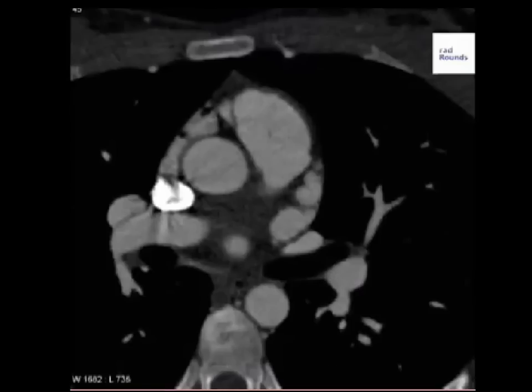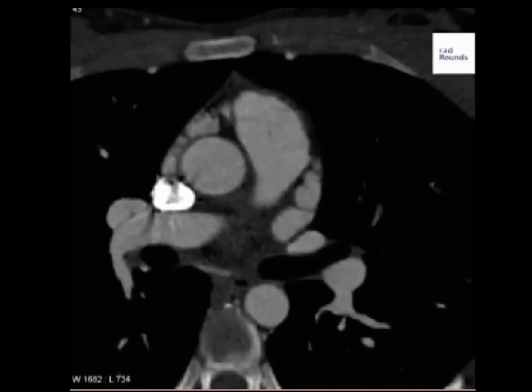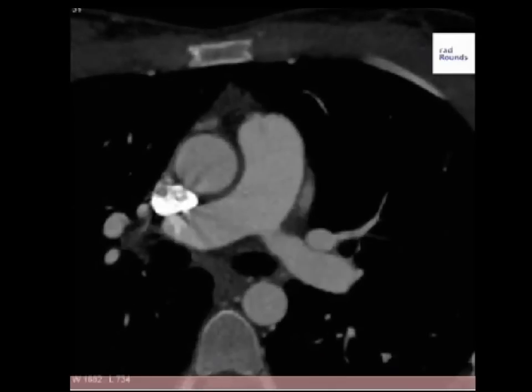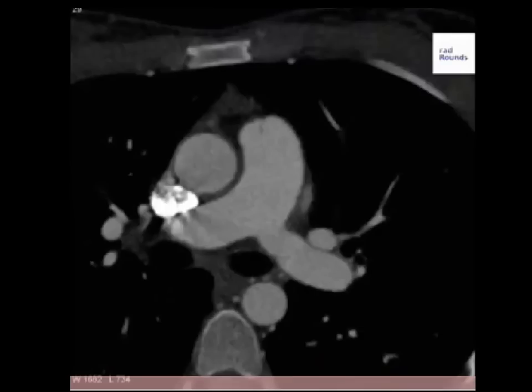Let me show you this first. Going up superiorly, that blood vessel branched off from a pulmonary artery. This is the main pulmonary trunk, this is the left pulmonary artery, and that blood vessel branched from the left pulmonary artery — so that was a branch of the pulmonary artery.